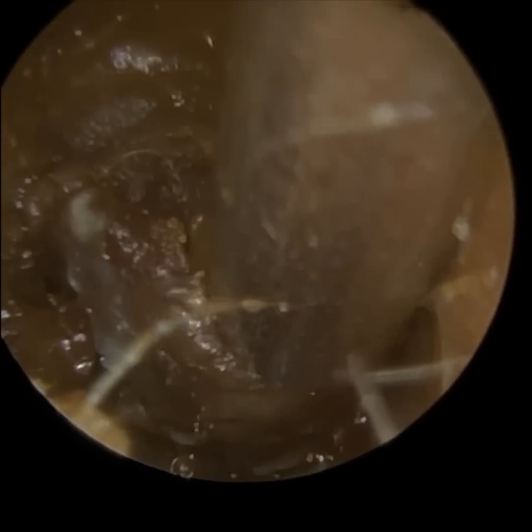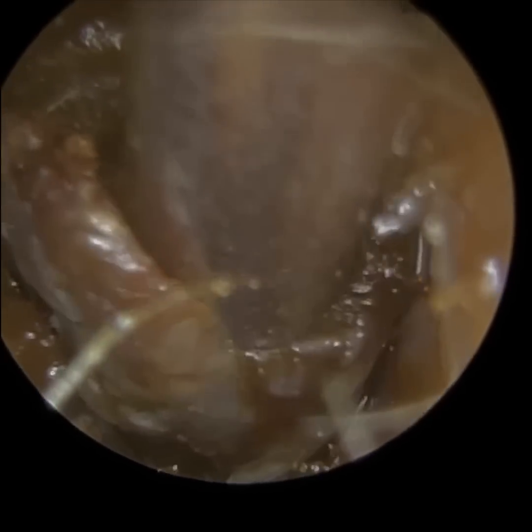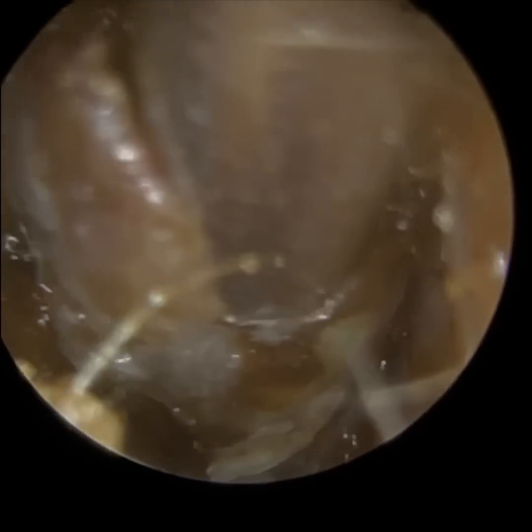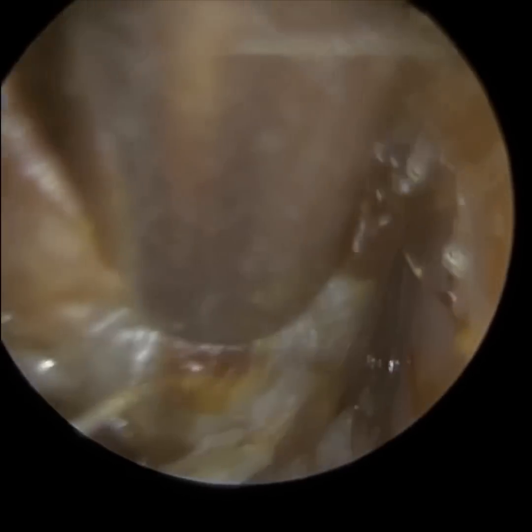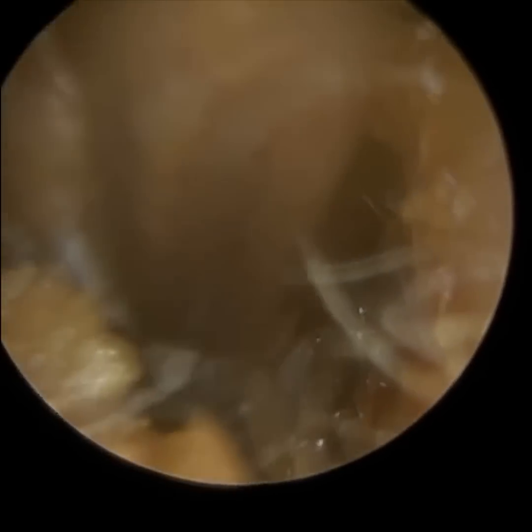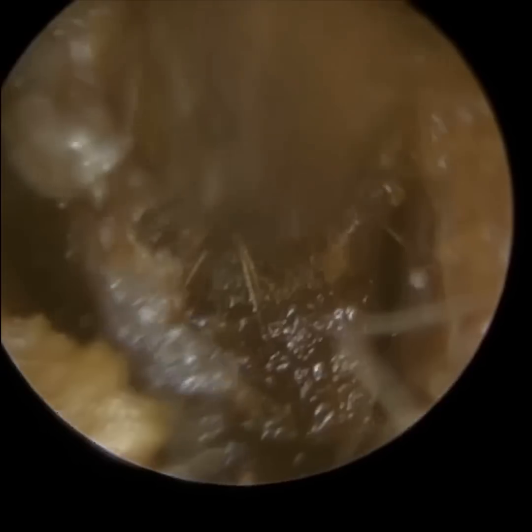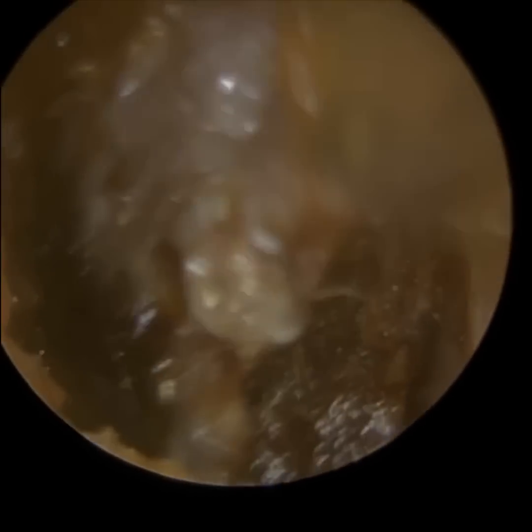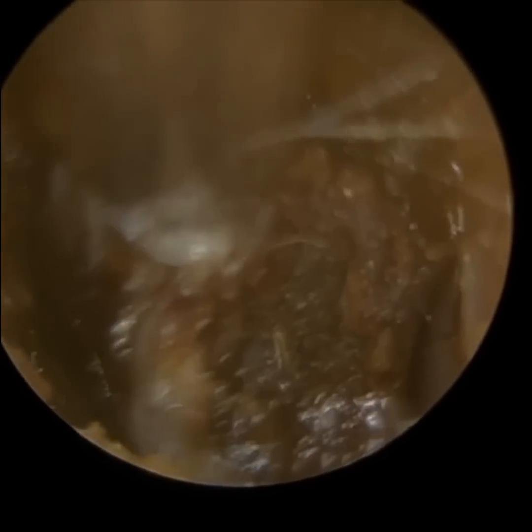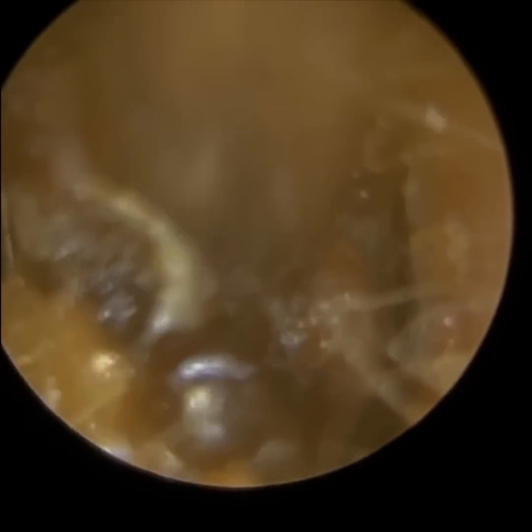You'll see a couple of those were really strongly attached to the eardrum, and we had to be very forceful in the sense where we had to manipulate that off the eardrum to release it. Now you can see the skin adhesions at the bottom. It's the white silvery matrix that's enveloped this wax plug. So that skin was once upon a time lining the skin of the ear canal itself, and that skin dies and it separates and it should shed out of the ear naturally. But here it's adhered itself and enveloped itself around the wax plug.